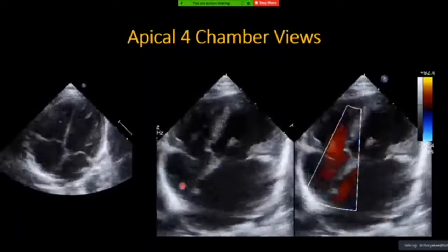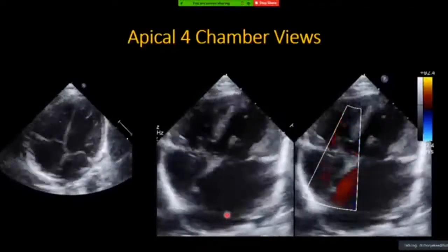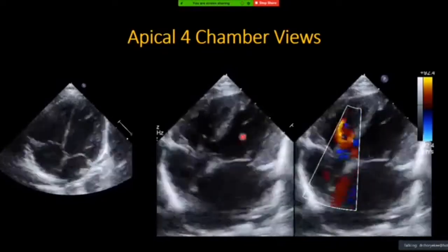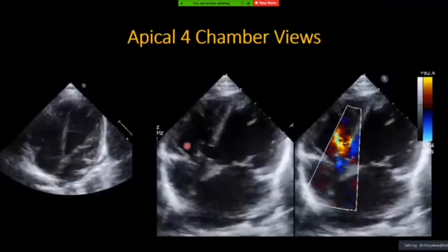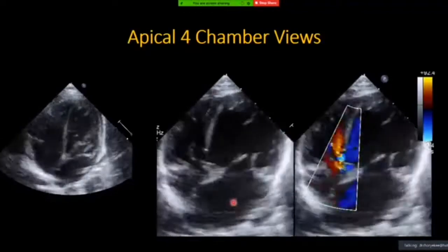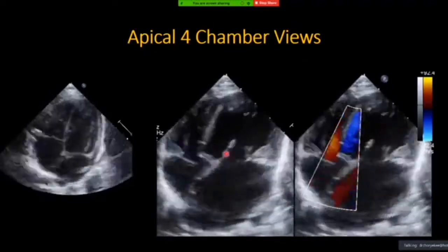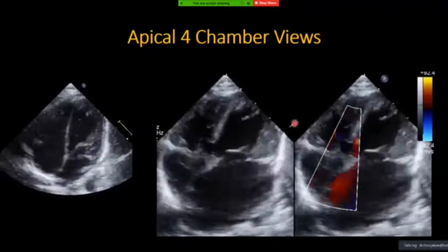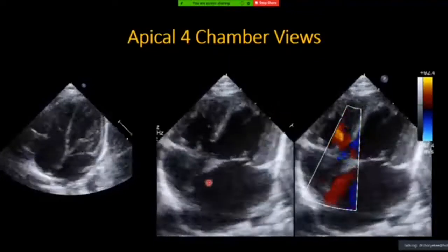When you look at it, what really impressed us is that the left atrium is much bigger than the right atrium. The left ventricle is very much bigger than the right ventricle. So one side's chambers are much bigger. On top of that, there's a significant large perimembranous VSD. So there has been significant overload. This child has been in failure, with left side dilatation and the VSD.